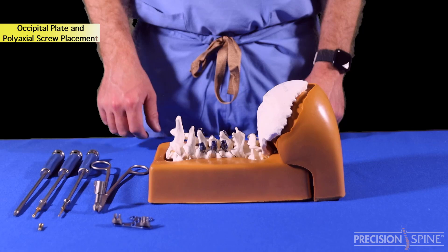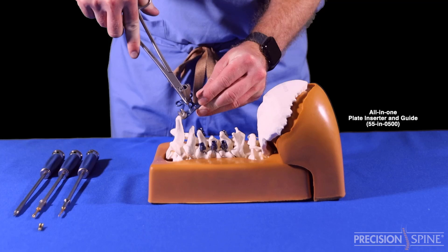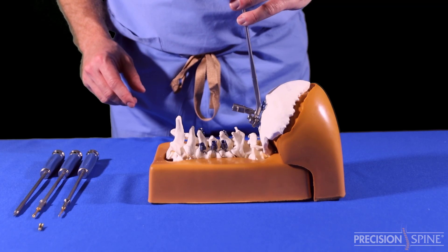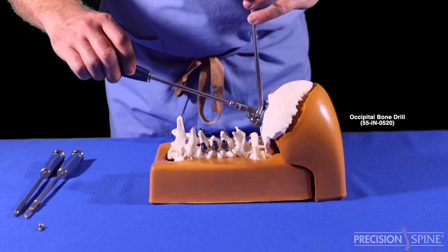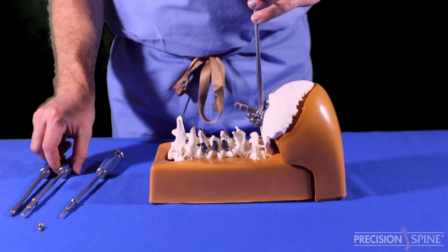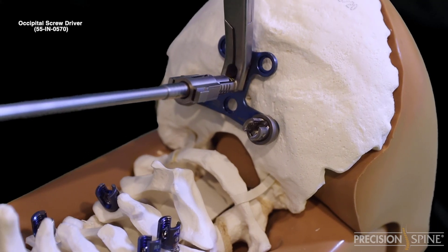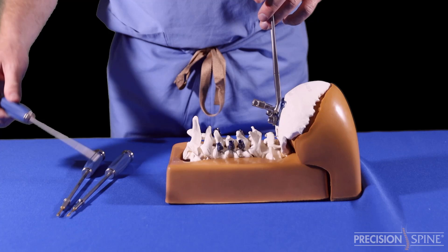Step 3: Occipital Plate and Polyaxial Screw Placement. Use the all-in-one plate inserter and guide to place the occipital plate. Set the depth indication of the guide to the desired depth and insert the occipital bone drill. Use the straight drill connected onto one of the inline modular handles. Next, the straight occipital bone tap. Finally, deliver the screw with the straight driver. Once the screw is fully seated into the plate, you can remove the plate inserter.